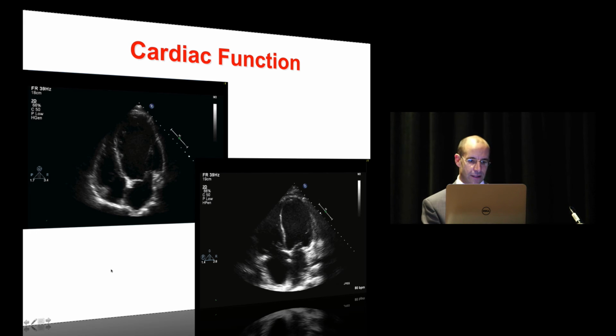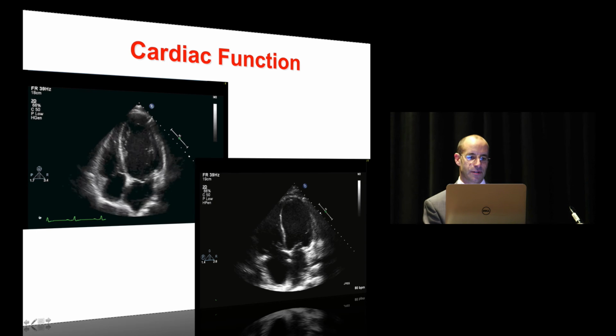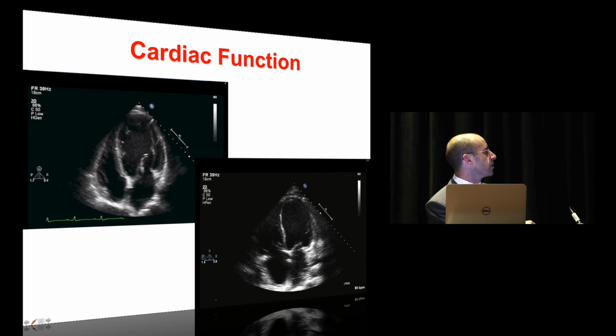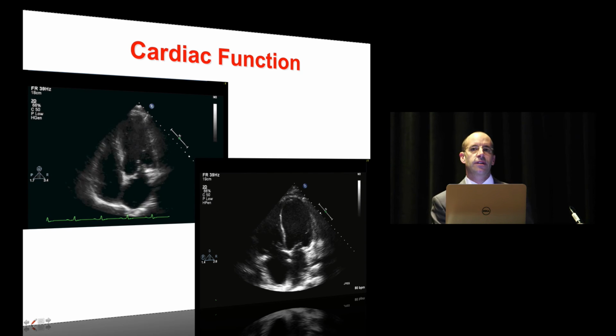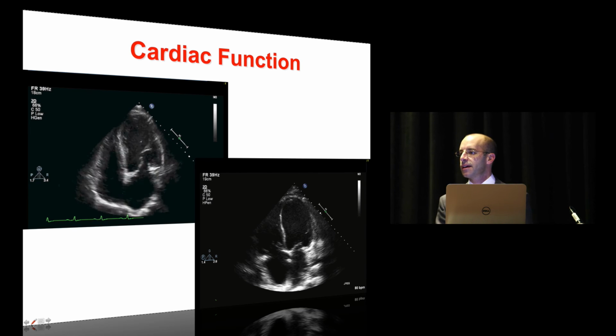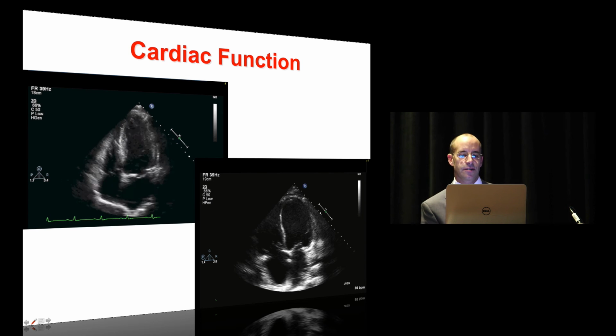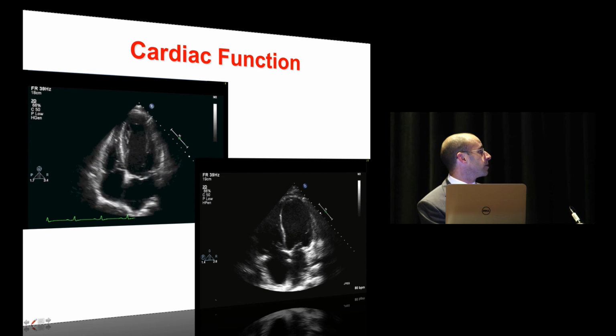So this image over here, if it starts, is basically a normal apical 4-chamber view. So what I'd be looking at is you look around to make sure there's no pericardial pathology. You're looking at the right ventricle and the left ventricle, and the valve function. You would always want to look at the comparison between the right and left ventricle. It should be 2/3 the size of the left ventricle. So if I see that contracting and there's a suspected PE, cardiovascular collapse, the likelihood is there's no embolic phenomenon because the right ventricle is not giving me any indication that there is increased right ventricular pressures.